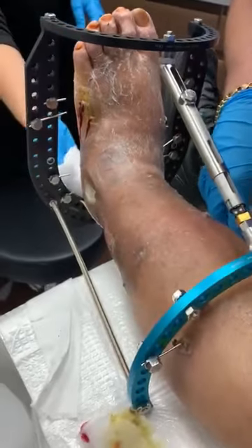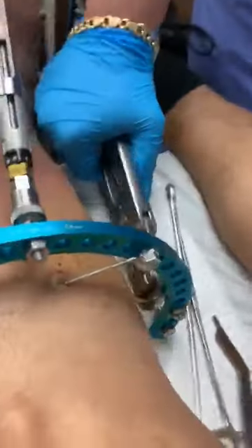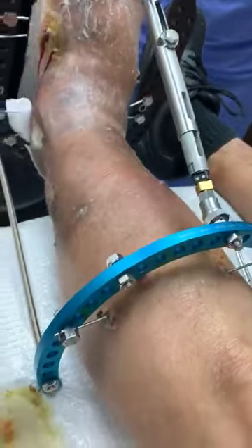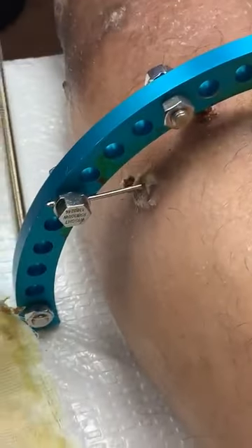I like that one that I was doing on that side — that one that I was always looking at. For some reason that one was at an angle or something. I'm trying to note them on the chart a little bit when they're coming out.